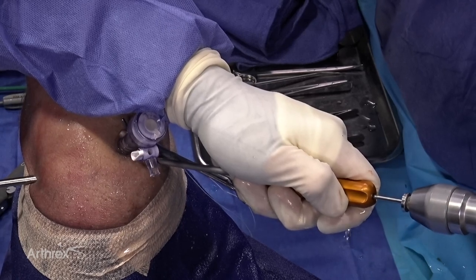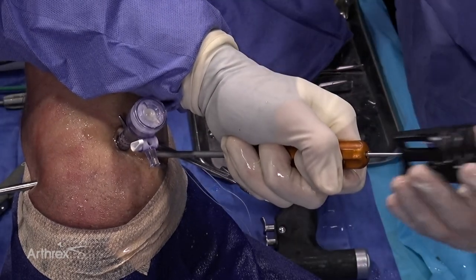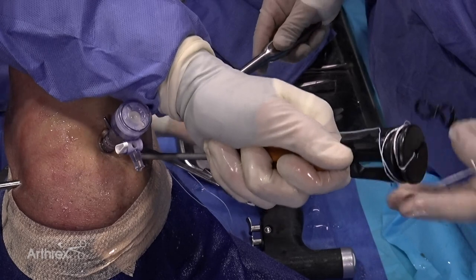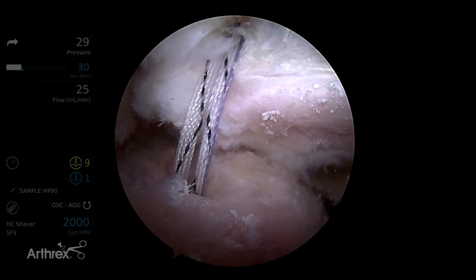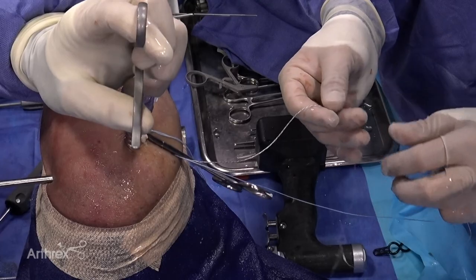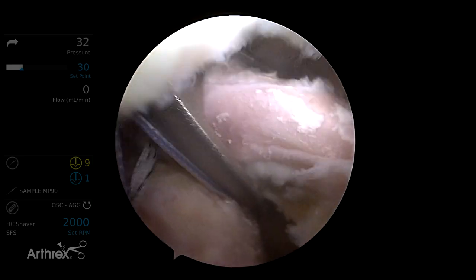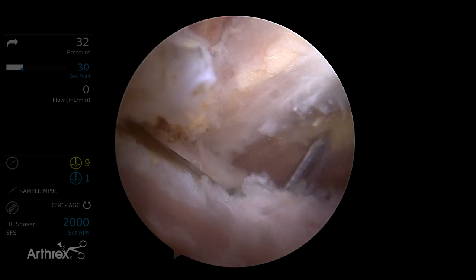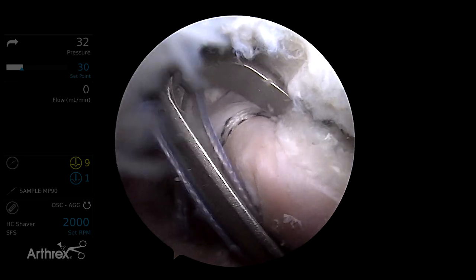I'll place the guide just in the medial aspect of the footprint, right where we'd want to bring this tendon down anatomically. This is our 2-6 knotless anchor with a number five coreless suture for our repair. We remove the black tab and pull back on the anchor — pulling back on the blue repair stitch of this self-bunching anchor will deploy the self-bunching mechanism. Through my ASL portal I'm going to retrieve the blue repair stitch. I've loaded this suture on a scorpion; I'll use an antegrade pass for the subscapularis tear, particularly on the upper aspect. A lever push helps increase the space so we can deploy our suture, pulling back on the cannula to clear the jaw of the scorpion.